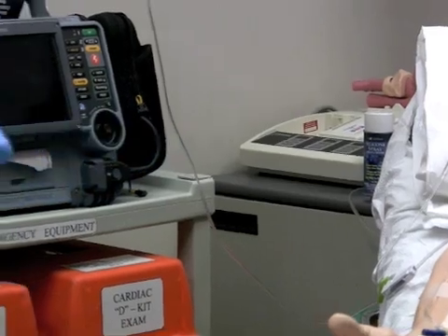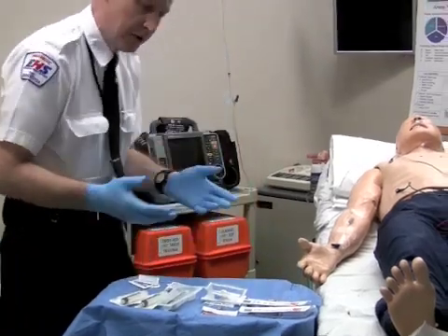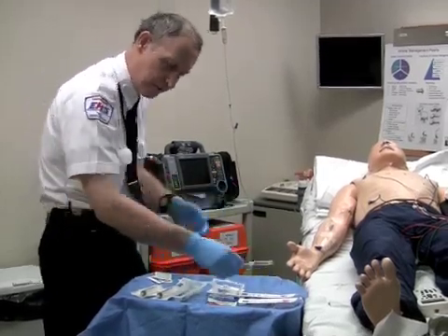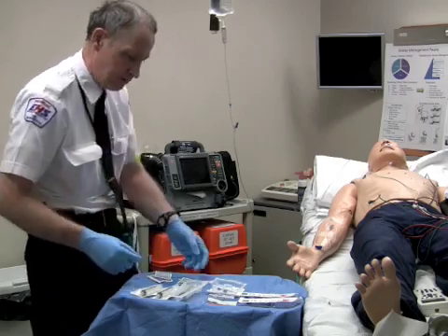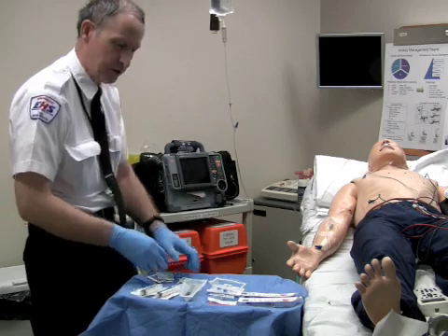We are going to give you an easy method here, or a suggestion at least, to use the three-way stopcock. In your kits, or at least what is available to you here, will be the traditional glass syringe times three, the stopcock that you are familiar with in the IO administration under saline pressure, a 20cc syringe, a 10cc syringe, and all the fixings.